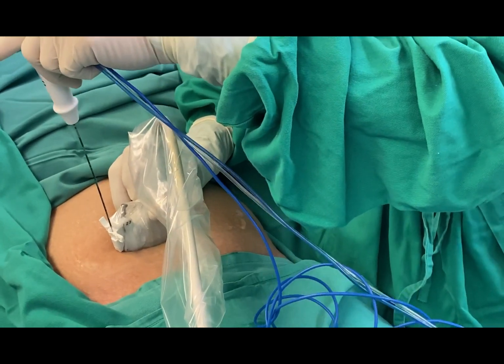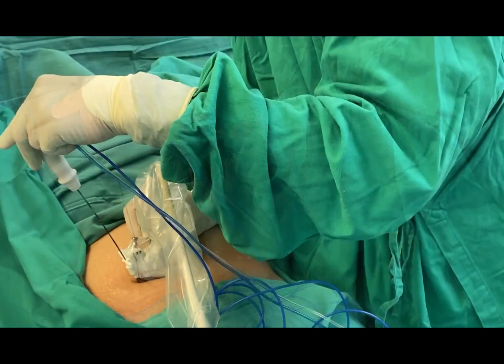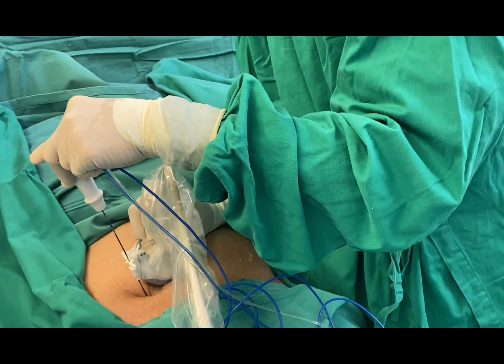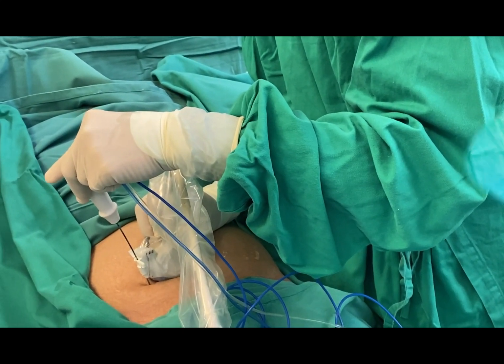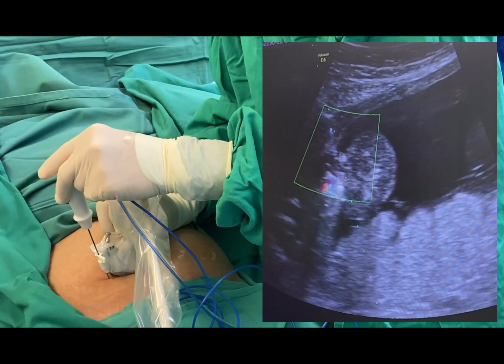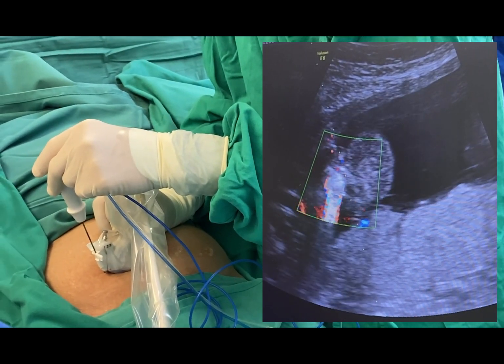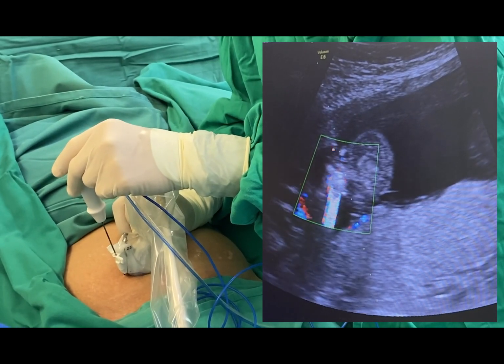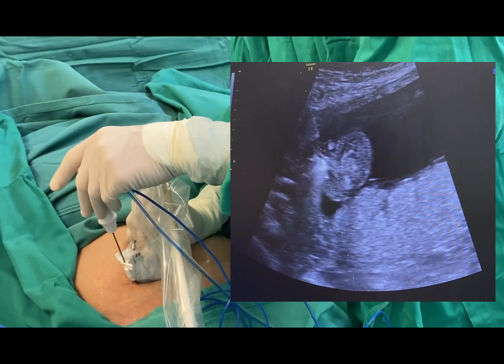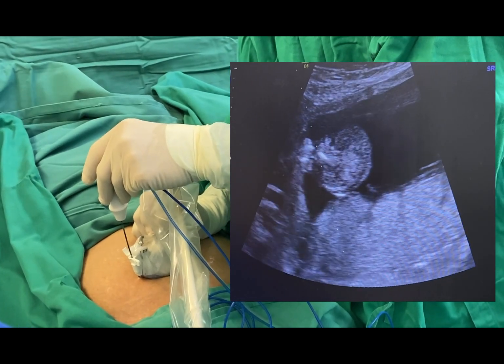This was the initial insertion of the needle into the fetus using a biopsy guide. We were not satisfied with the position, therefore the needle was removed from the fetus while maintaining it within the subcutaneous tissue.